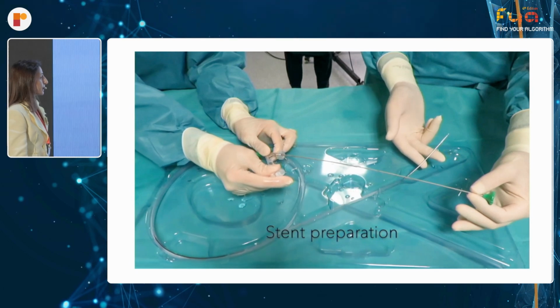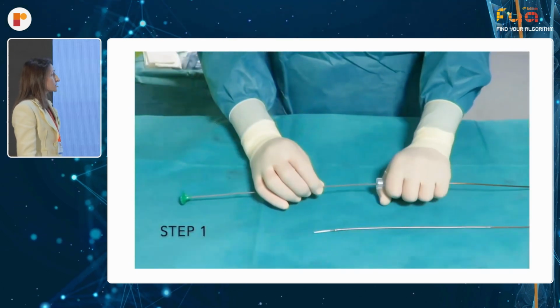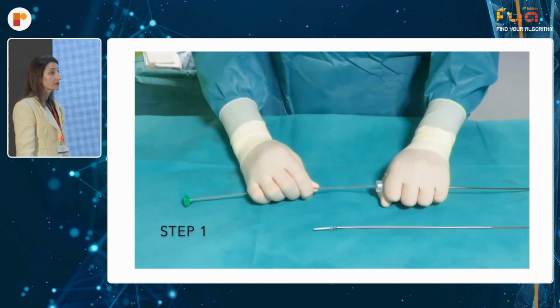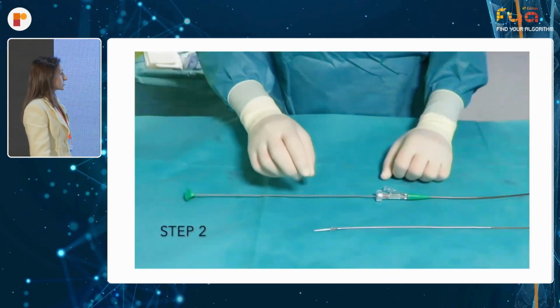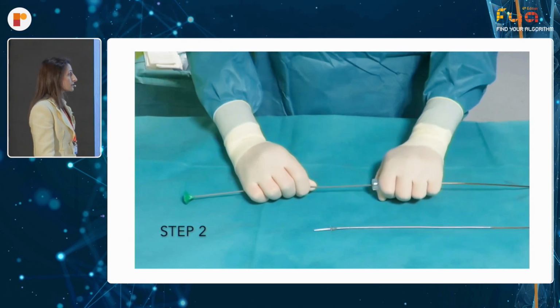You'll see it's a simple deployment. You will see different steps. Step 1 is just pushing a little bit in order to open 1 centimeter of the stent. Now you will see under X-ray. Step 2 is the pull and push handle maneuver.